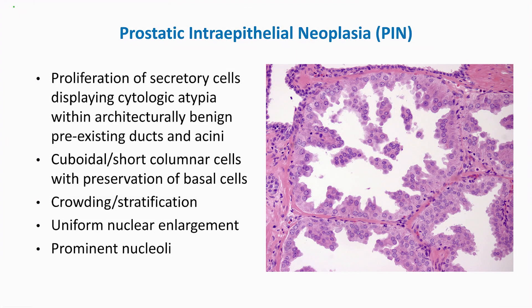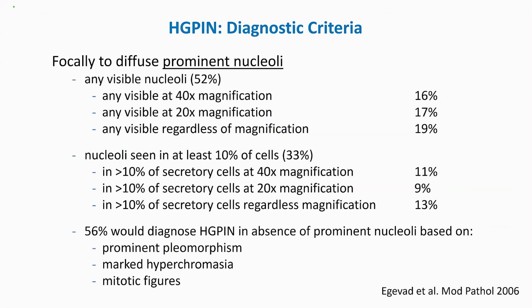There is uniform nuclear enlargement compared to the benign glands at the periphery of the microphotograph. Prominent nucleoli are also seen, and this is one of the characteristic features of high-grade PIN. Diagnostic criteria for high-grade PIN have been evaluated by different investigators, showing variability. However, focal to diffuse prominent nucleoli is one of the most important criteria that everybody seems to agree upon.